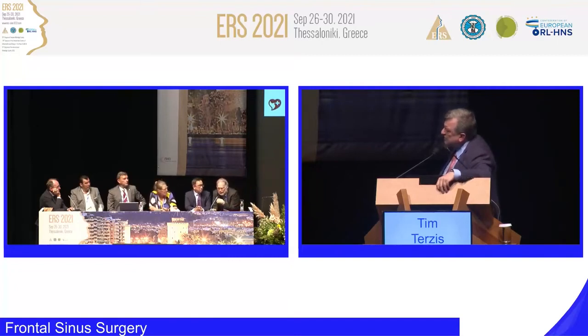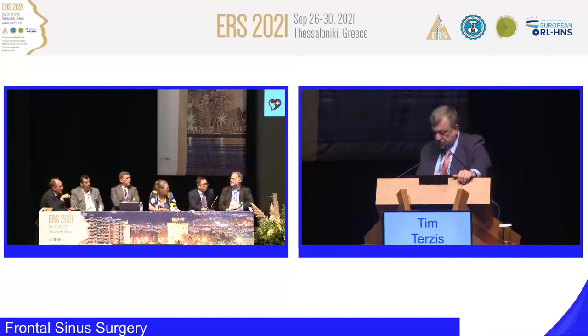Yes, Phillipe? I think that when we do a Draf 2B, we must drill a lot. Yes. And at the beginning, we think that, well, the opening is okay, it will heal. No, you have to drill a lot, and you must remember that when you think it's enough, the procedure starts. That's a very important thing. Yes, good point.